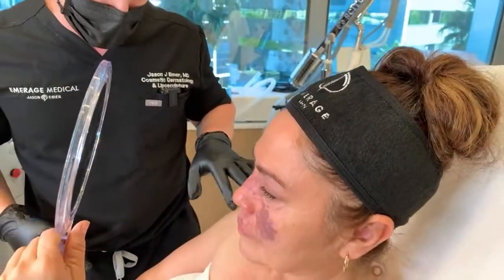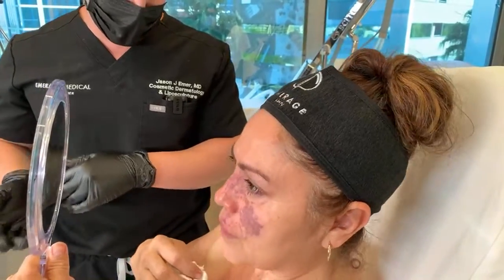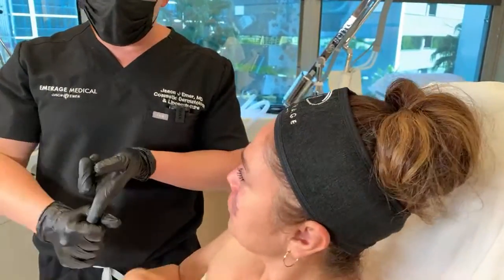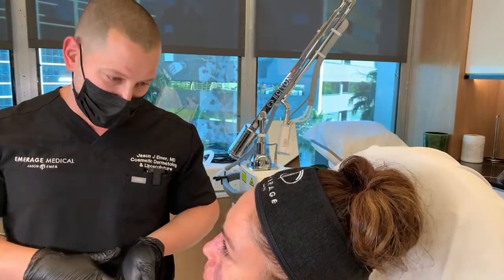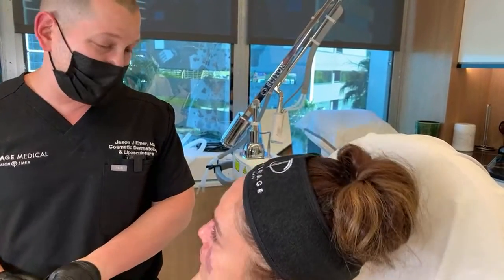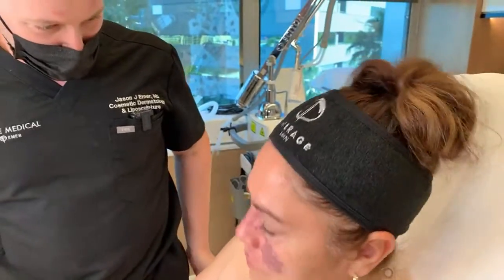That's very good — it means the blood vessels are actually constricting, all the blood in there is going to shrink and then go. That's the goal. So again, in three weeks we do a second treatment. What she'll do now — because this is going to get irritated and turn a little dark — is use growth factors, stem cells, and hyaluronic acid to make sure the skin barrier is good so you don't get a scar or any pigmentation. I have a feeling based on this we might get 50% clearance in one treatment.